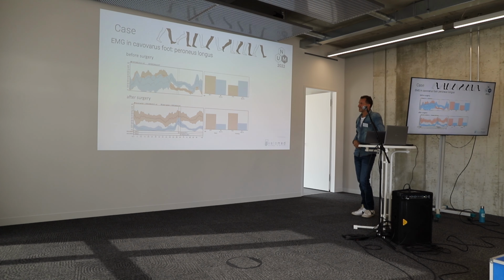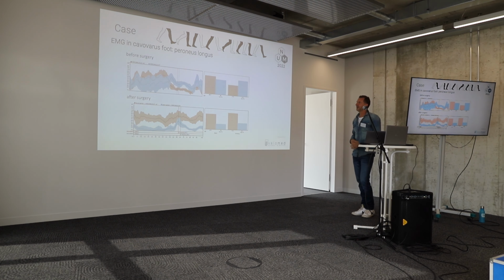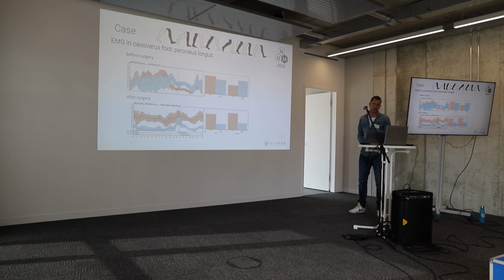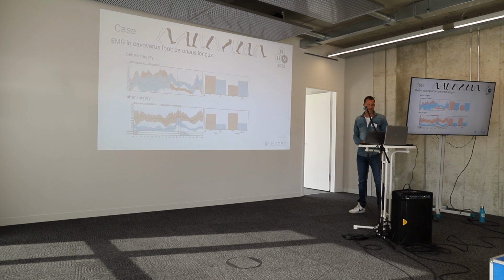So another point which is very interesting, and it creates so many questions also for me, is that the activity, you remember, before the surgery, before the operation, was really pretty high. So was it pretty high? We have no reference ranges, we don't know it, but it was pretty high. Most of all in contrast to the result after surgery. You see the peroneus muscle here, the peroneus longus, had a pretty low activity. Is that good? Was that the result? To give that kind of result to a patient whose only reason to come was lateral ankle instability.